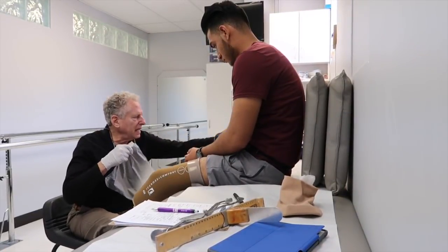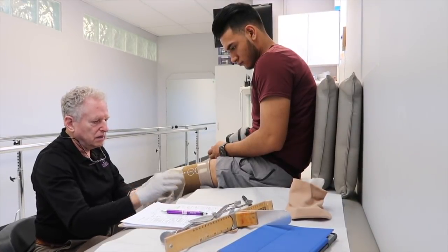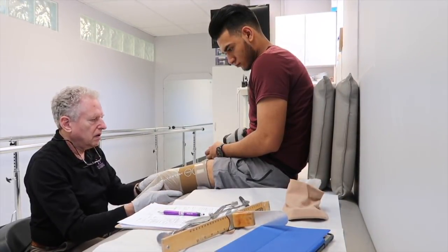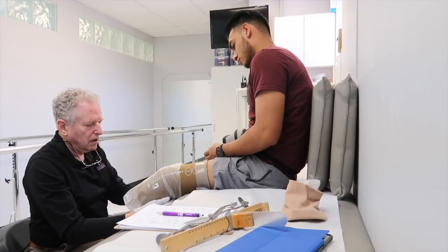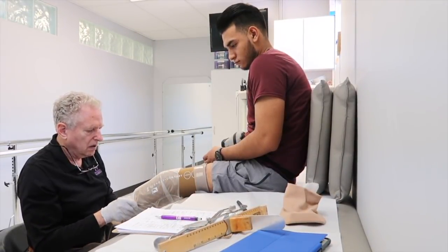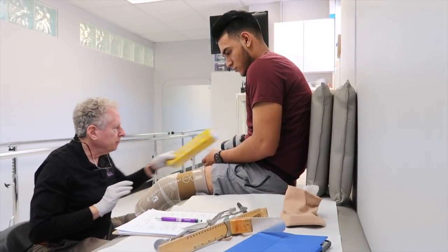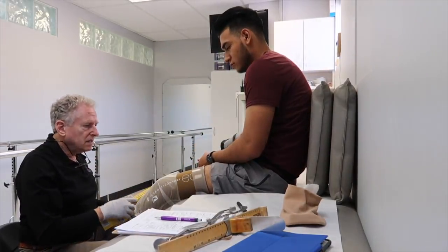He's gonna put on this plastic wrap to keep the water and the plaster off the liner. He wants to keep my leg straight — just like that.